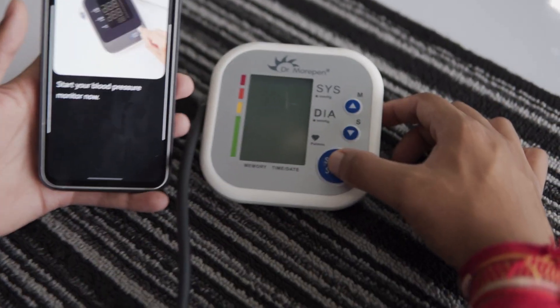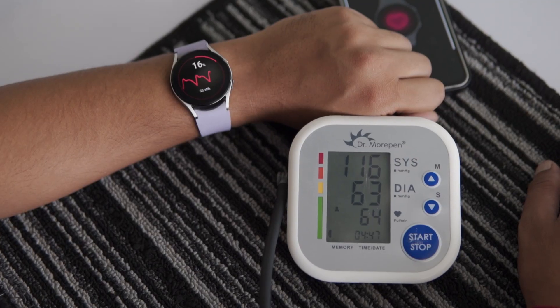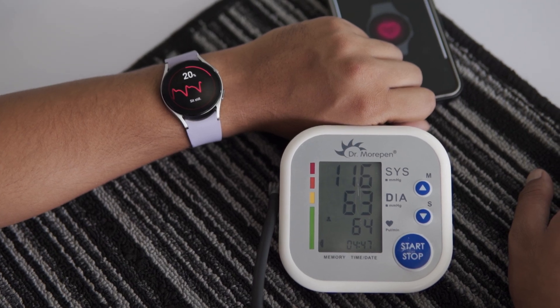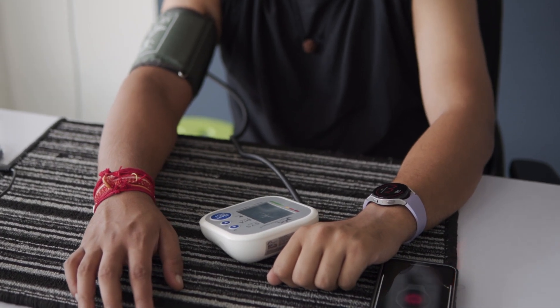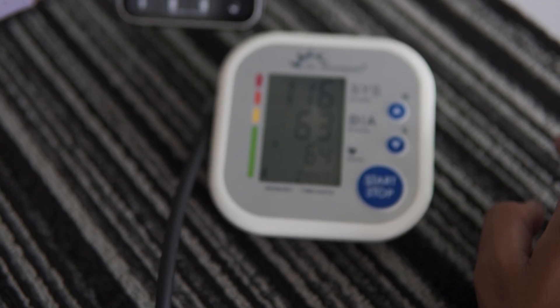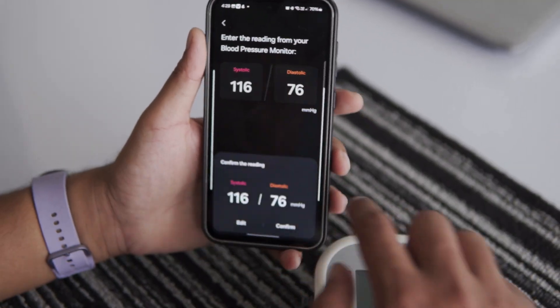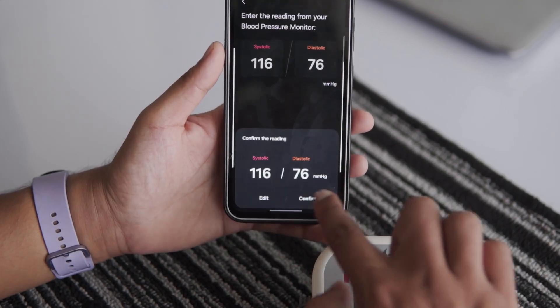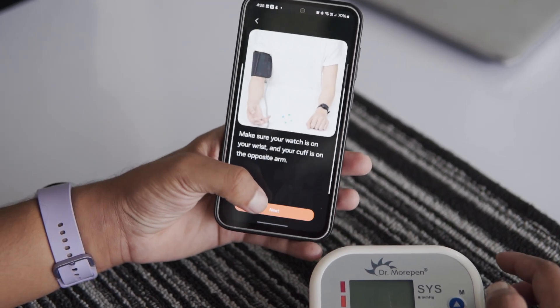I start the monitor and the watch begins measuring my blood pressure automatically. While the measurement is in progress on both the watch and the monitor, I need to sit still and relax. It takes a bit of time. Once the watch finishes the measurement, I need to enter the reading from the blood pressure monitor into the app for calibration. I enter the details on my phone, and that completes the second step.